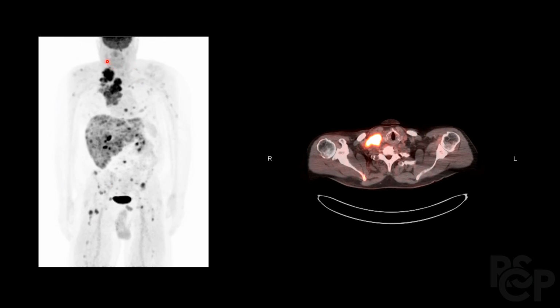Now over here we notice increase in FDG uptake over here and the lungs and throughout the liver. So this is concerning for metastatic disease. And usually you'd start off by looking at a MIP scan and then hone in on the specific areas of concern, and then look at the axial views. So over here we can notice how there's increased uptake of FDG over here as well, which is correlating with the areas above the lungs. So again, this is concerning for metastatic disease.